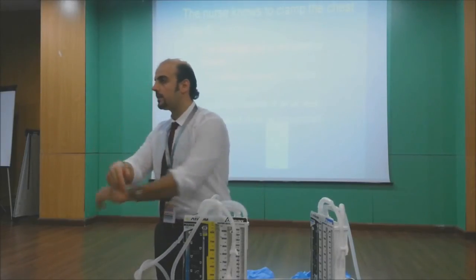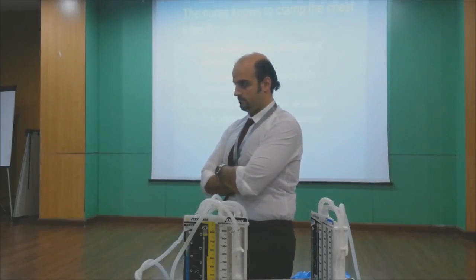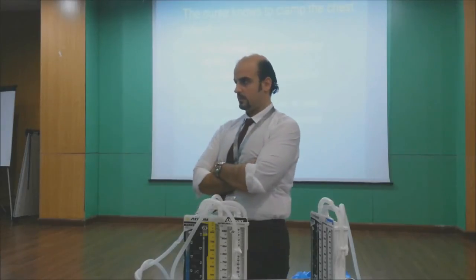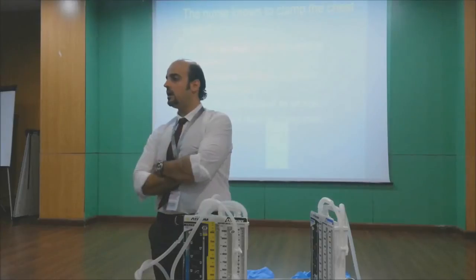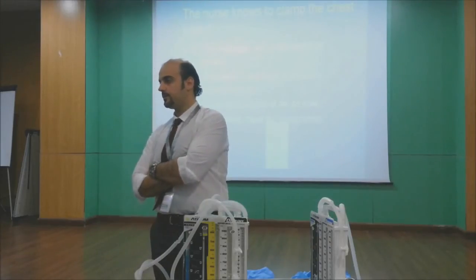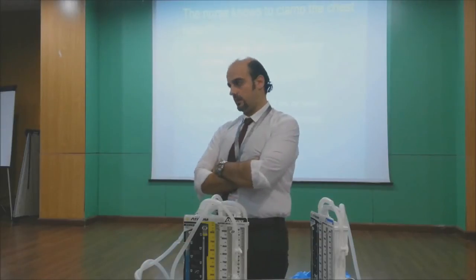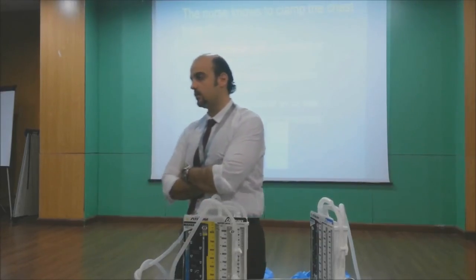My question is: if the water is finished and the staff for a long time did not notice, or something happened, they are busy with the patient, what can happen if the water is finished? Will there be any side effect or no? It will affect as a prolonged time. Maybe it will affect the mechanism of the chest tube.